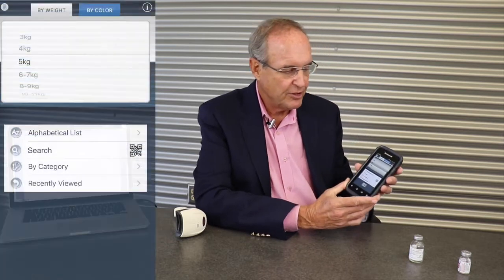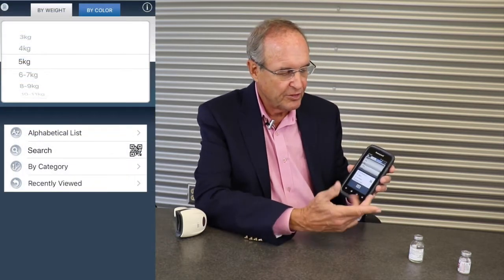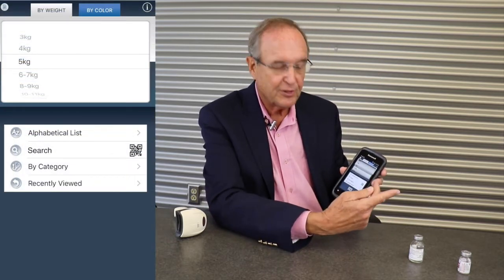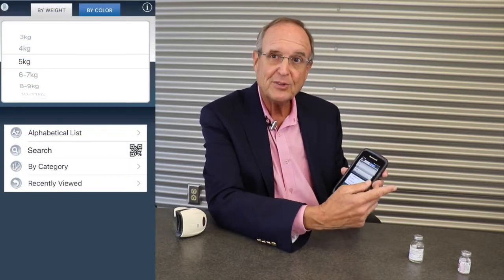I'd like to show you our SafeDose scan application within a Honeywell upper level scanner. As you can see, I have set SafeDose to 5 kilograms.